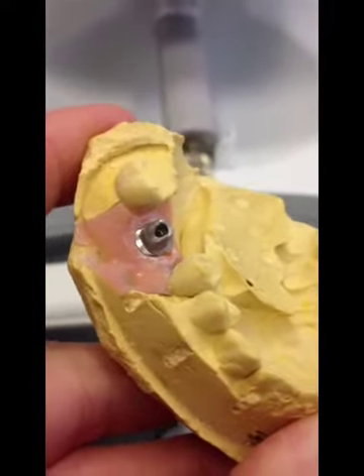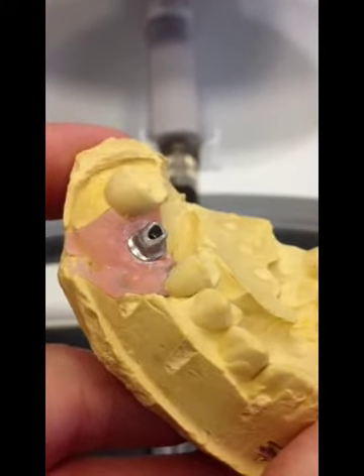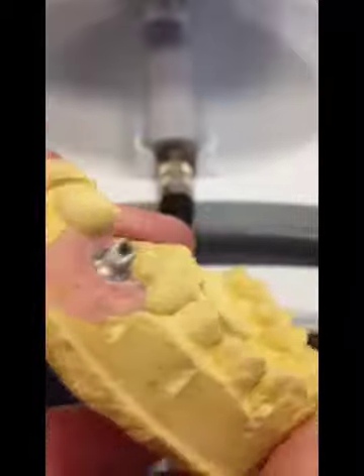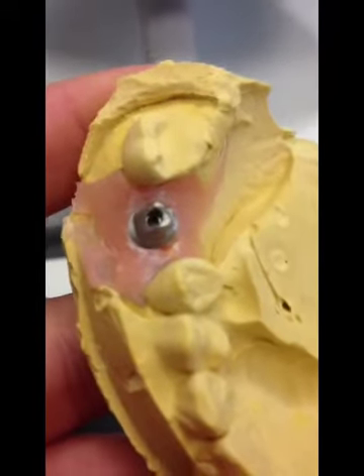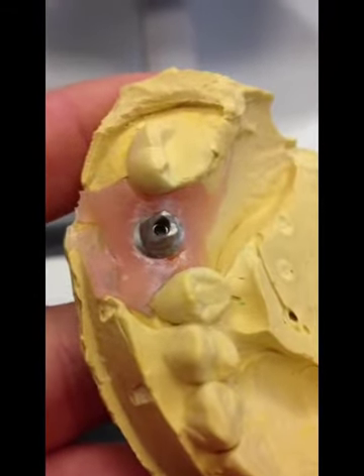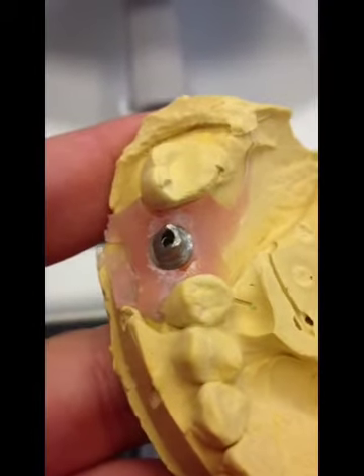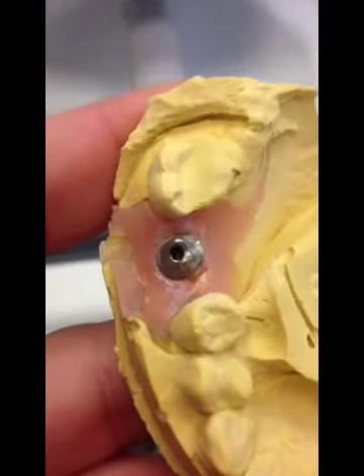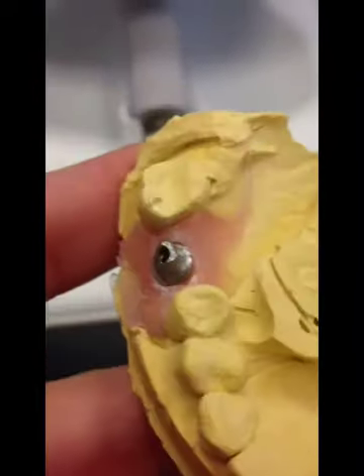We've got the implant abutment in here, and basically we've shaped it down. It's a 6.0 platform, pretty big implant. But what we're going to do is we're going to scan this into the E4D. I'm also not going to tell you how to do that, because if you have an E4D, you already know how to scan crowns in.